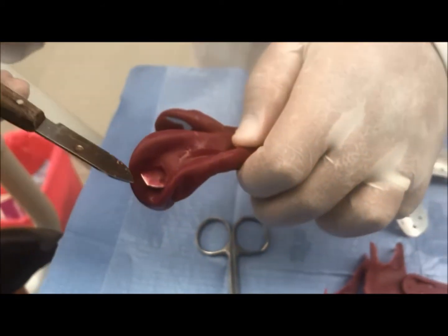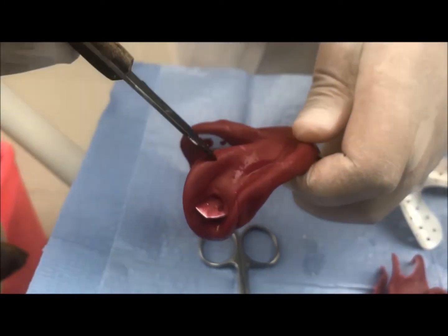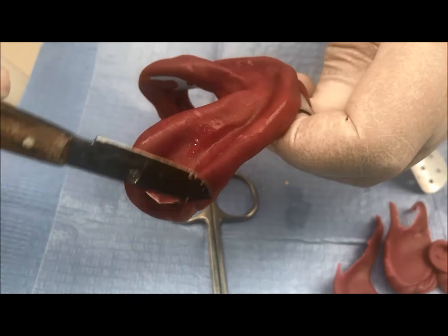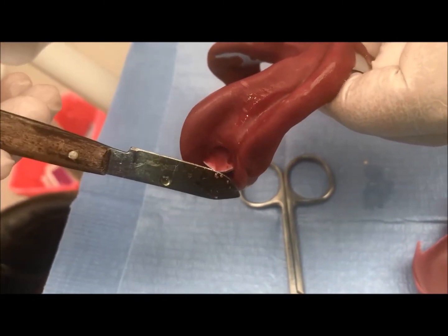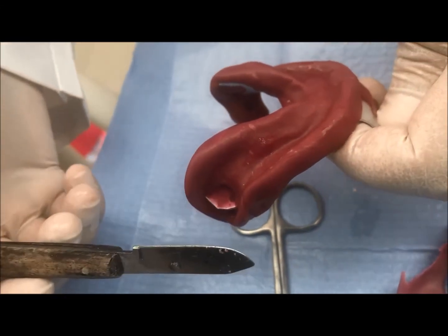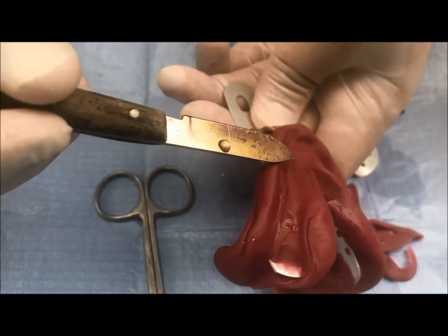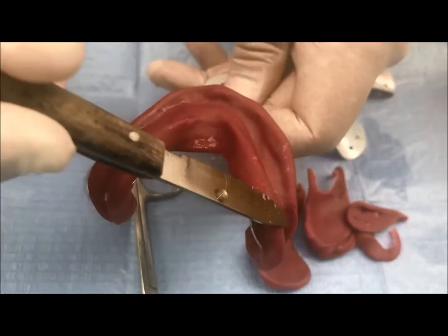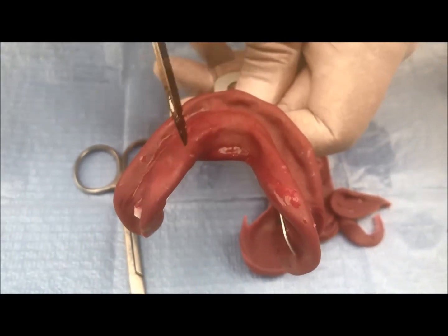The lingual pouch is recorded — going up and then down to the alveolingual sulcus and to the lingual frenum. At the disto-buccal area, the masseter influence area is recorded by asking the patient to close against resistance; it is smooth and rounded, and not extending horizontally at the cheek but vertical and smooth. On both sides it is recorded by the same technique. The thickness of the compound at the lingual side and buccal side is uniform on both sides, confirming that the impression itself is not shifted.